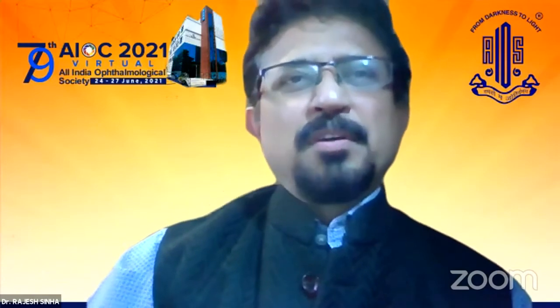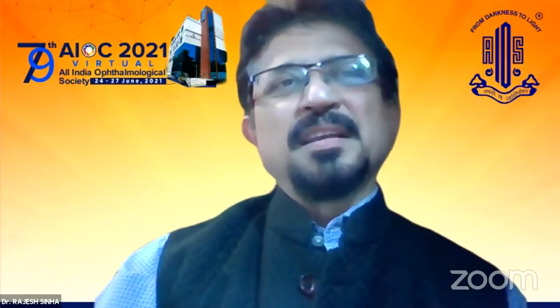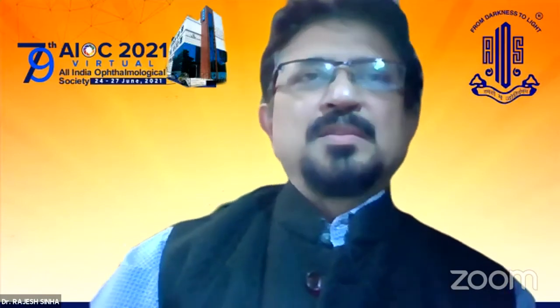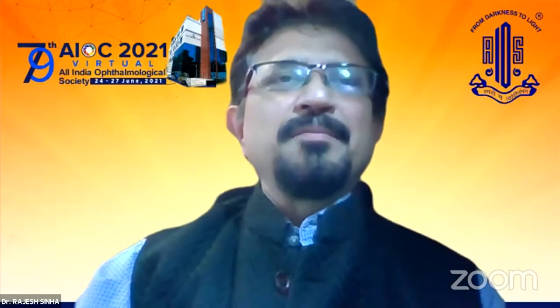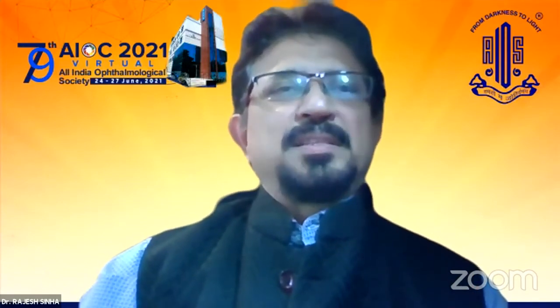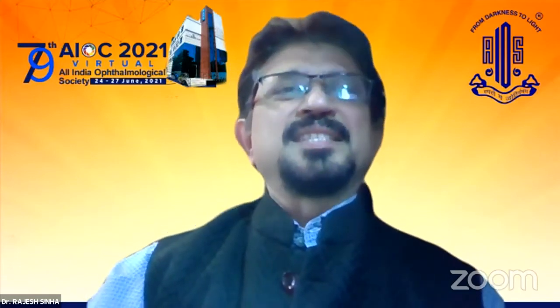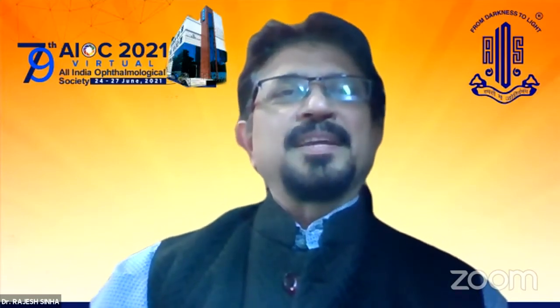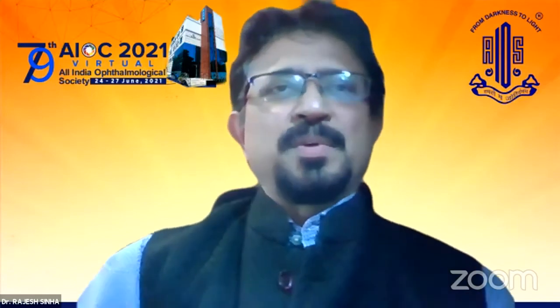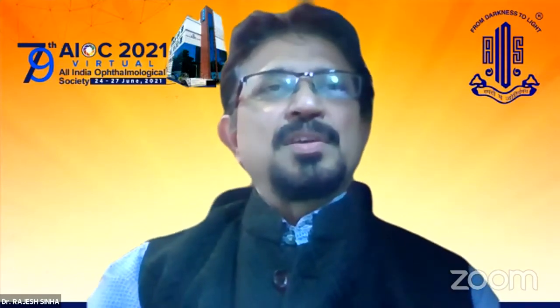Second, because of a long life, the risk of iris atrophy and disenclavation is high. Point number two is that even with anterior chamber IOLs, the very first phakic implants we started with was the anterior iris clip, wherein the crystalline lens was also there behind and there was support.